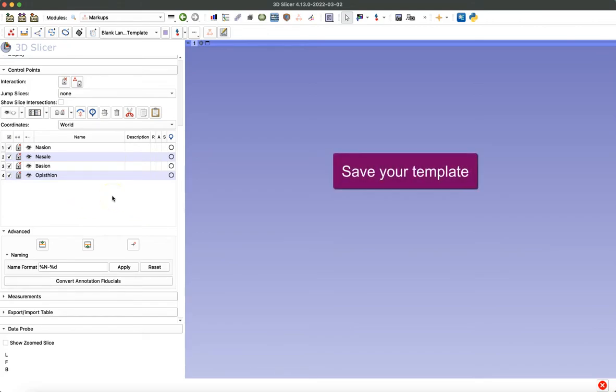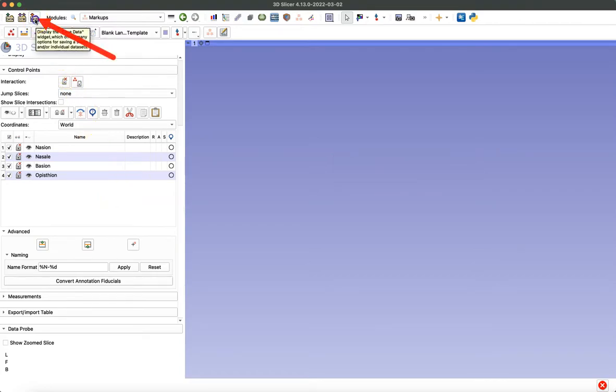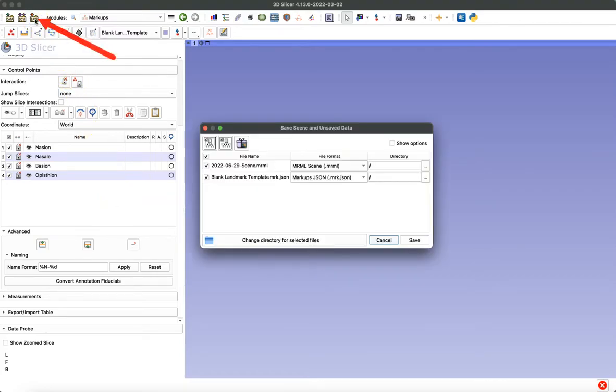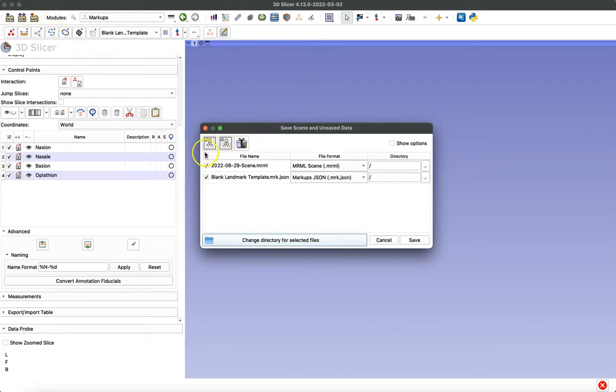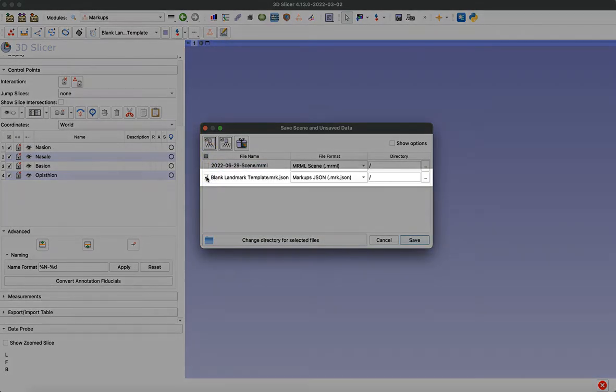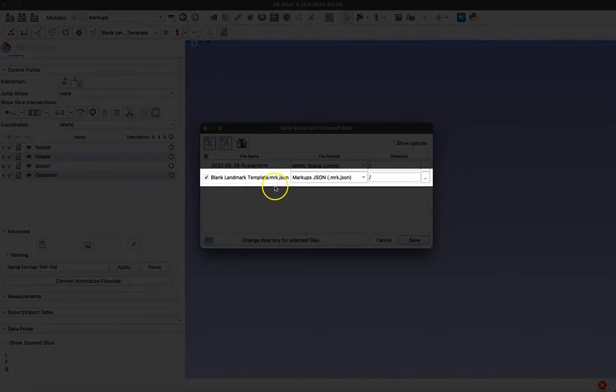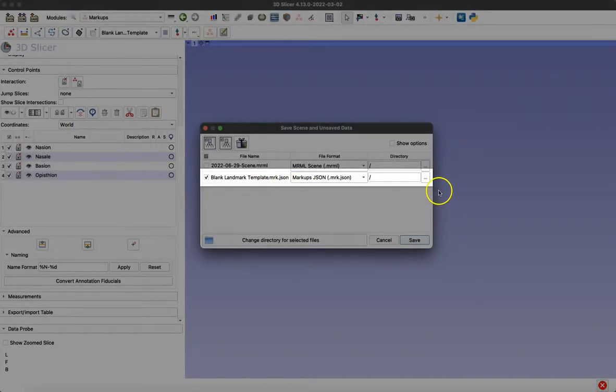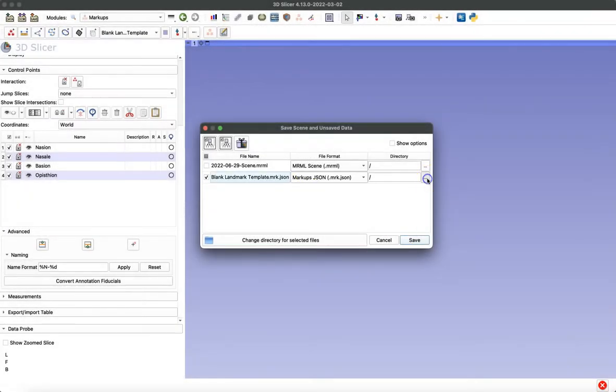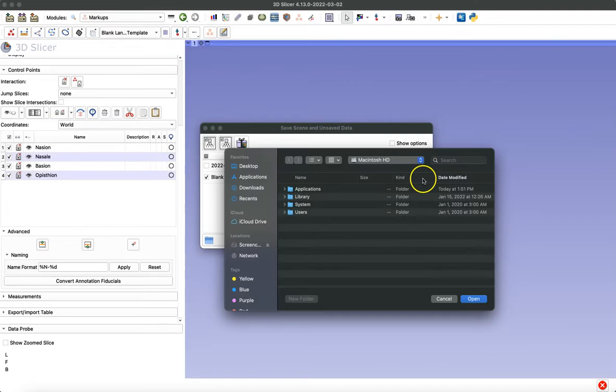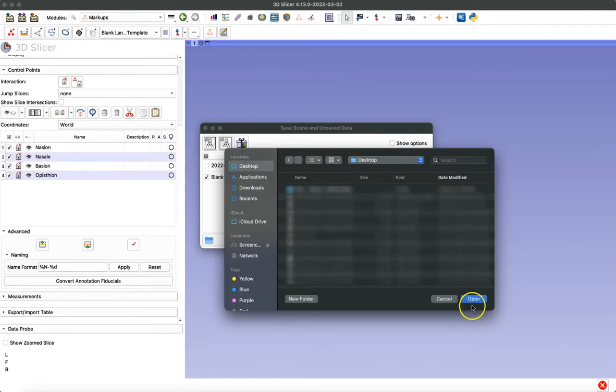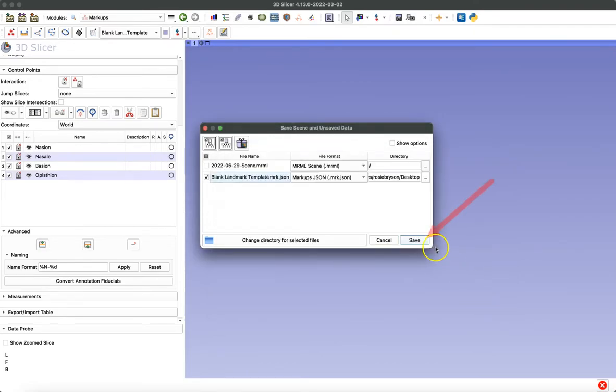The last step is to save your template. I'm going to click the save icon at the top. I don't want to save the scene as well, so I'm going to deselect everything by clicking that check mark and then only selecting my blank landmark template. You want to make sure that you're saving it as a markups.json file and that you've selected a directory for it to go to. I'm just going to save it to the desktop and click save.